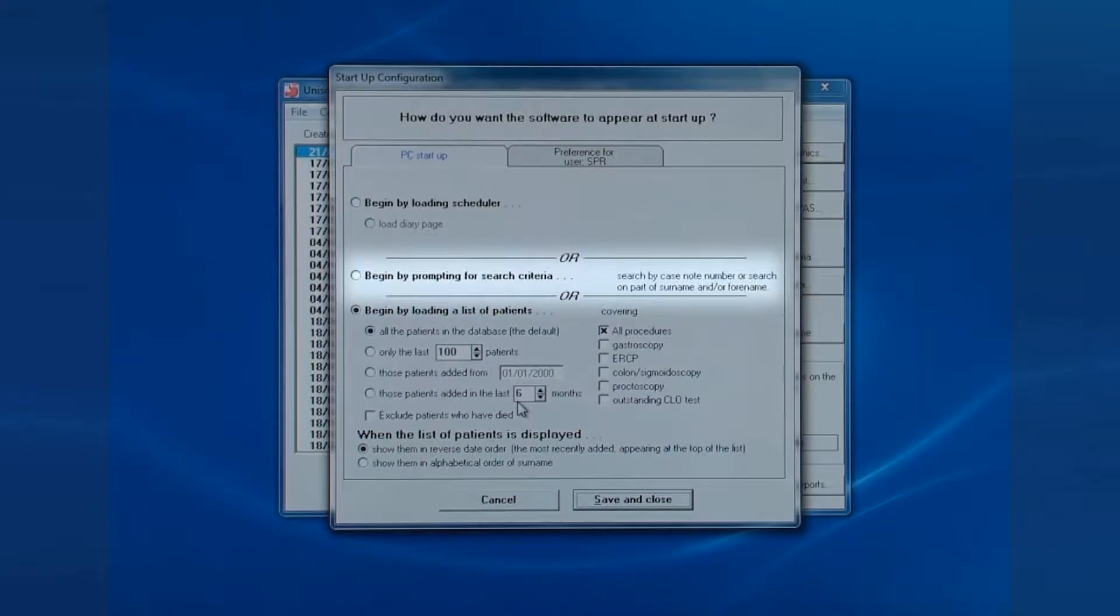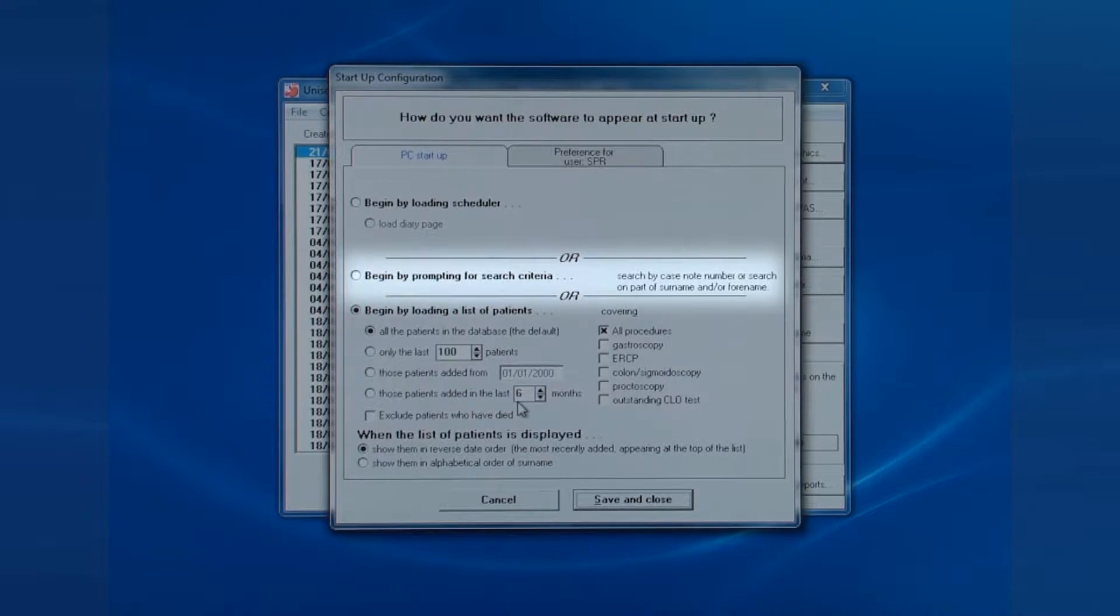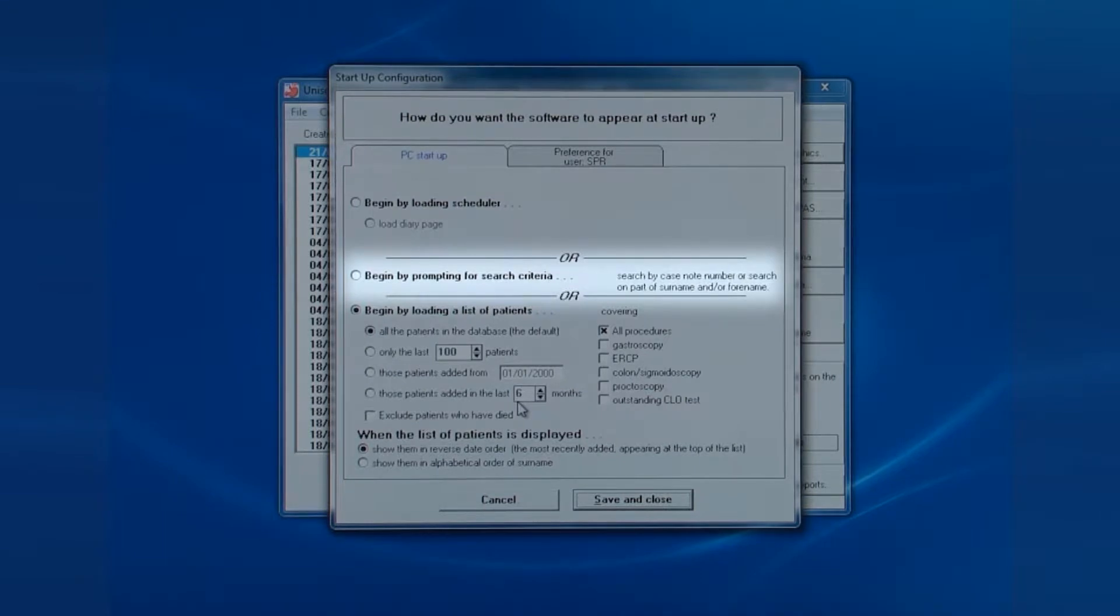However, it is more popular to have the screen displaying search criteria. This prompts the user to enter either a case note number, a medical record number, or surname and should be used in the endoscopy rooms as this reduces the risk of selecting a wrong patient.